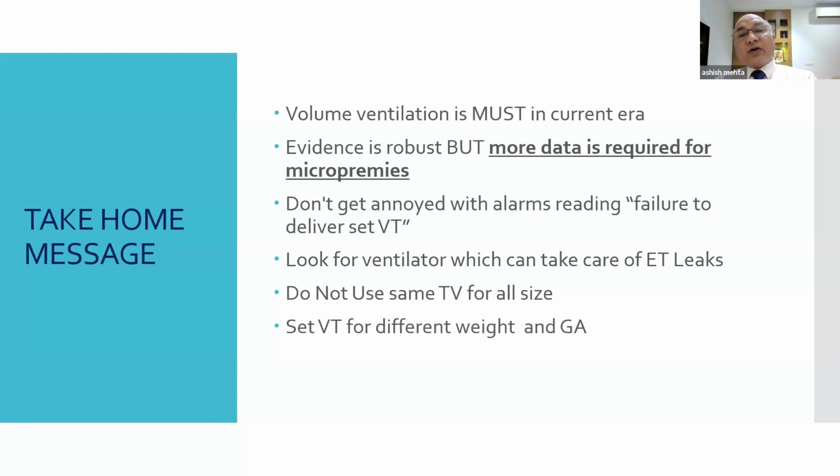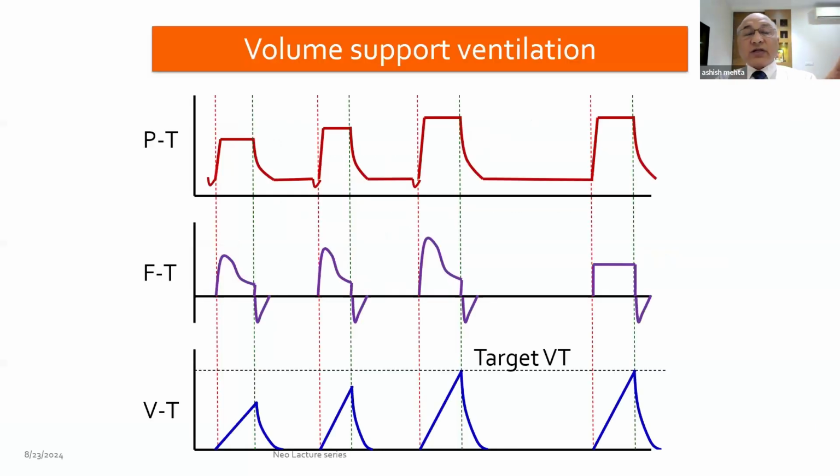Set tidal volume is different for different babies, different ages and different weights. So try to find out the right number which can help your baby.